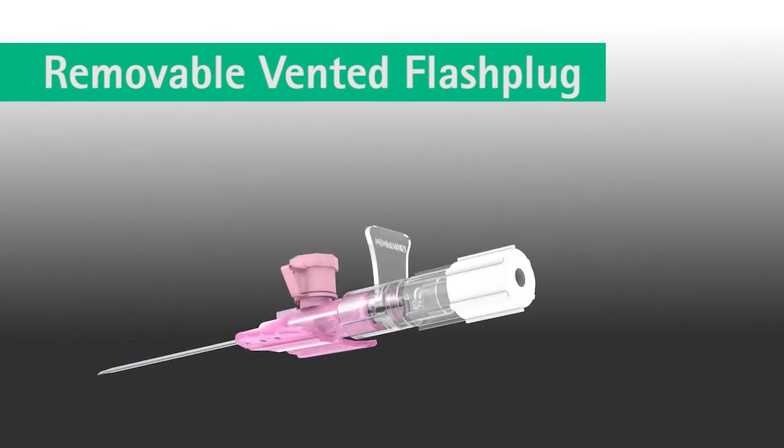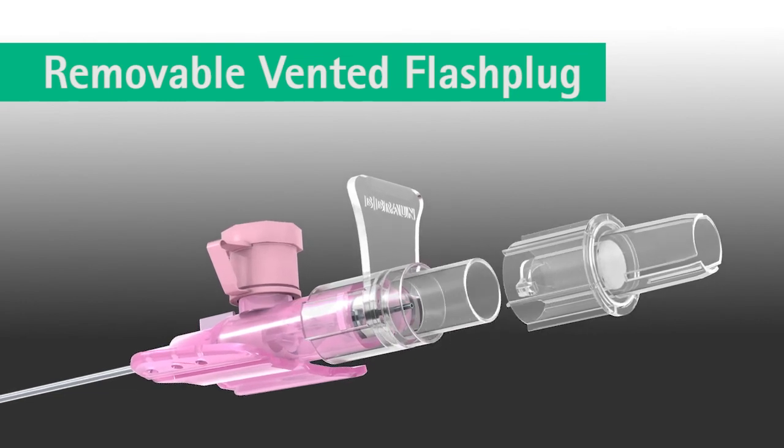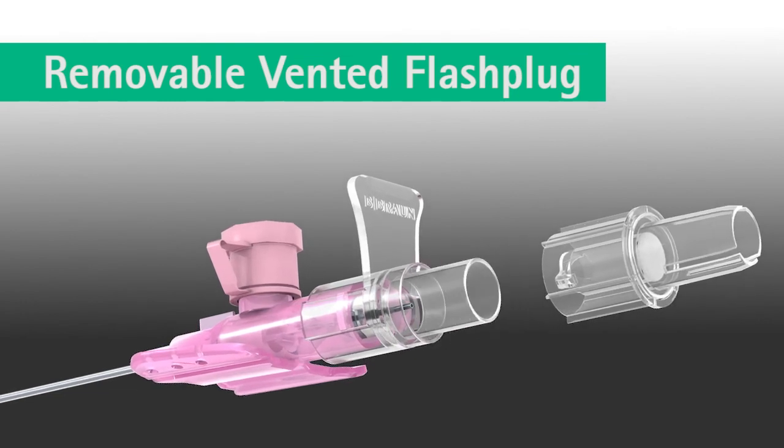The removable vented flash plug provides additional versatility to the Varsafix safety IV catheter. The flash plug can be replaced with a syringe or blood collection access device prior to insertion.